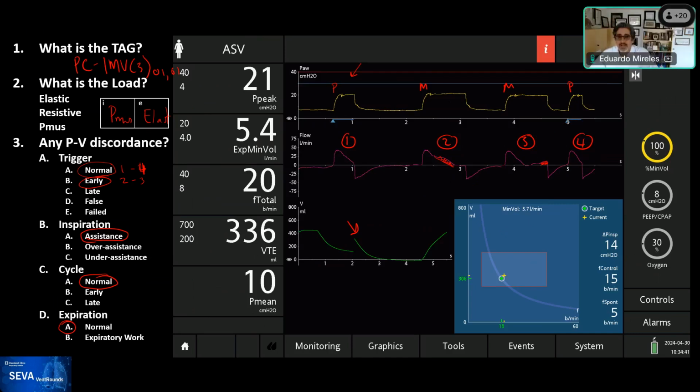Well, that's a great point, Rob. So as we think about patient-ventilator interactions, there may be some benefits, obviously, from the standpoint of gas exchange when you think about guaranteed minute ventilation, but that favors safety more than comfort. And from the standpoint of comfort, a mode like IMV type 2 focuses more on the comfort part, meaning synchrony, than when you're using a type 3 IMV, at least how it's implemented here.